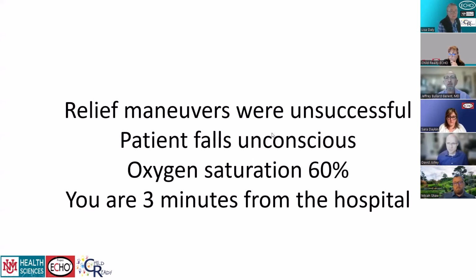But as the hospital, those of you that are in the hospital, what are you going to do to prepare for this patient when you get a message? We had about a 2-minute warning, which we used to get all of our equipment ready. I want you to think for a brief minute, what are you going to prepare? We prepared lots of different equipment, specifically direct laryngoscope. We prepared McGill's. We had our endotracheal tubes. We were very prepared when this particular patient arrived because I had a lot of resources.